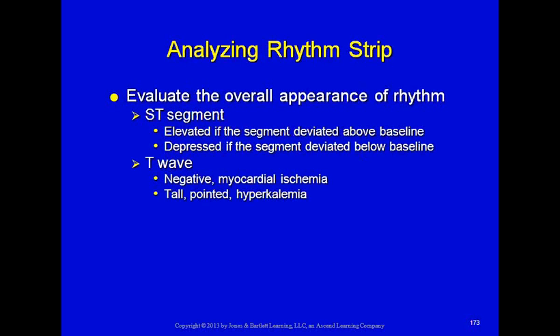Okay. You're also going to look at the ST segment. If it's elevated or depressed, that might give you an indication that you're dealing with ischemia or injury. You're going to look at that T wave. If the T wave is inverted, that's going to indicate ischemia, and if it's peaked or pointed, that's going to indicate hyperkalemia.